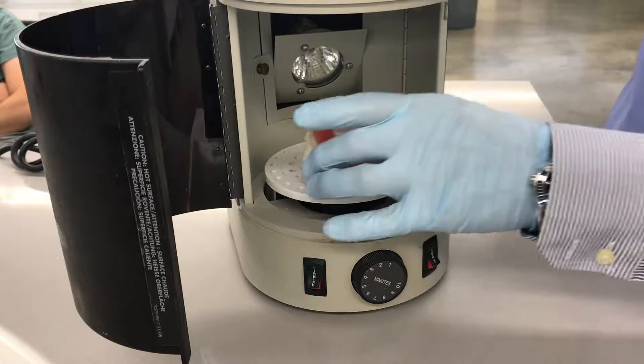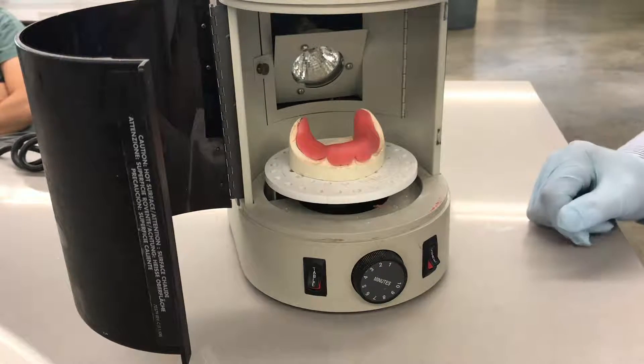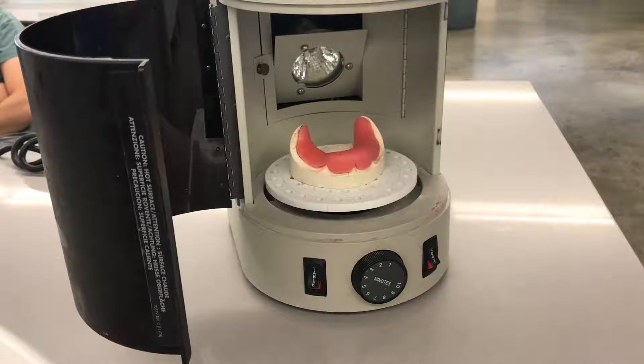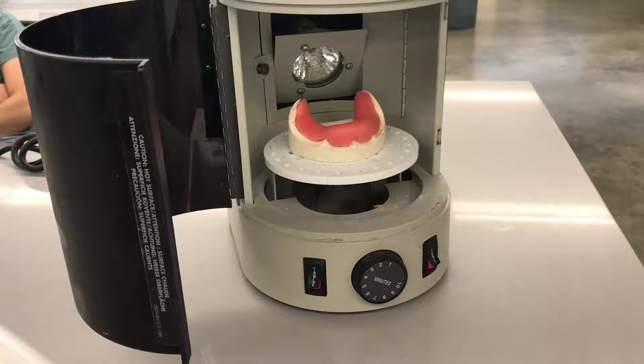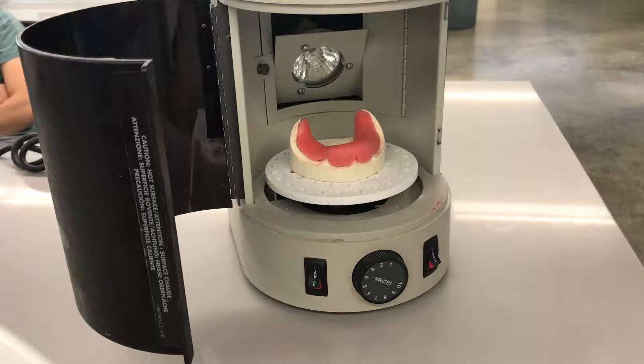So when you're placing the tray inside and center to the table, when the light comes on, you can raise it or lower it to maximize the exposure to the light.